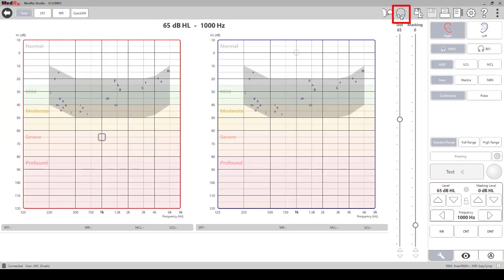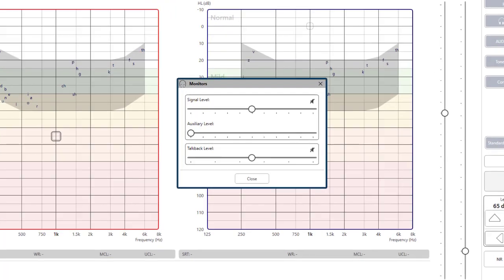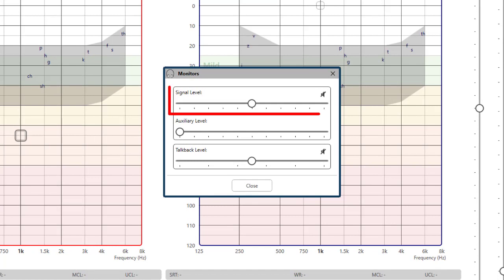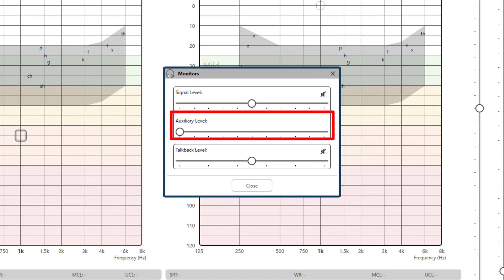Click on the headset icon. This controls your monitor headset. The signal level controls the volume of the beeps and words. The auxiliary level is used to hear and control the volume level of the masking stimulus when masking is used.